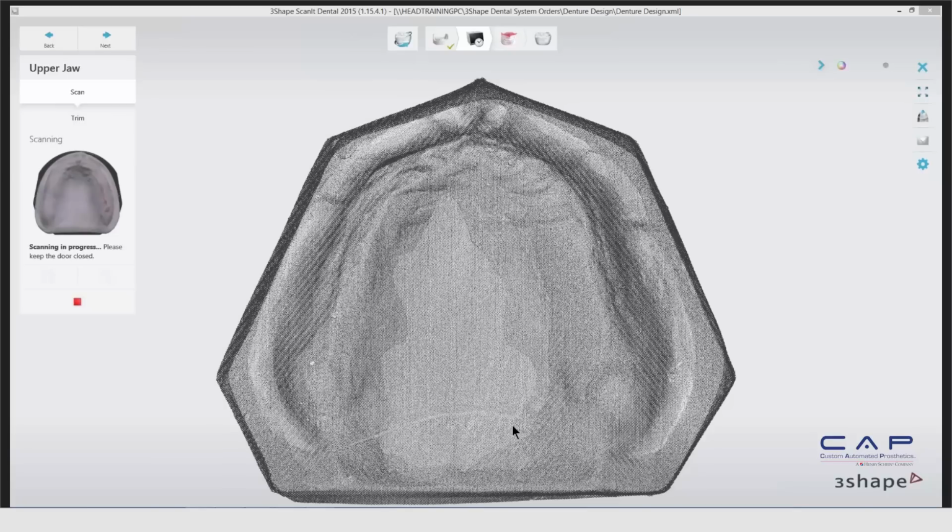If you notice, we started at 11:25 and it's 11:28 right now. So we've already gone, or 11:29. We've already gone 4 minutes in, and it's just started post-processing of the second scan. So it's probably going to take about 8 minutes for the whole scanning process. Okay.